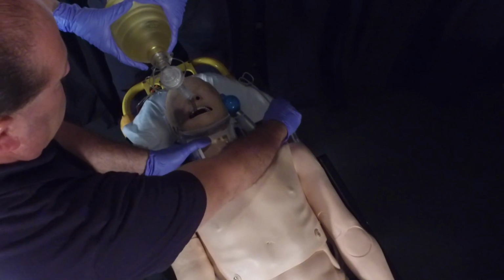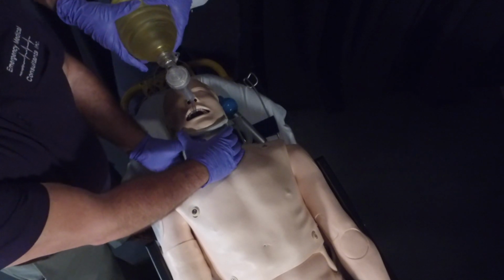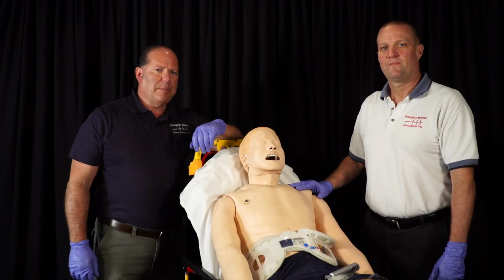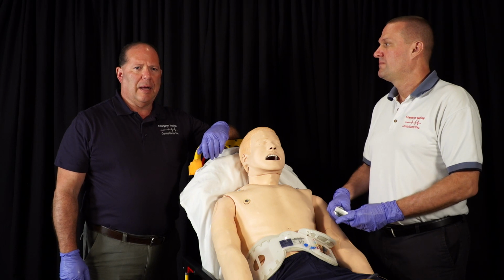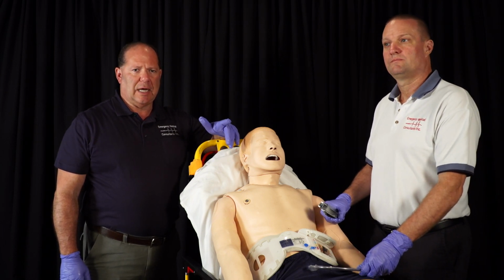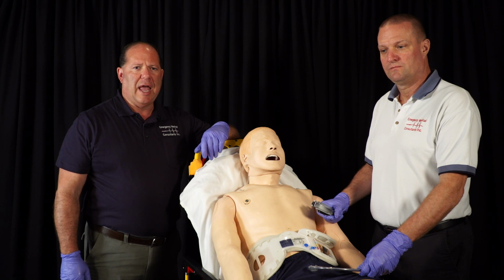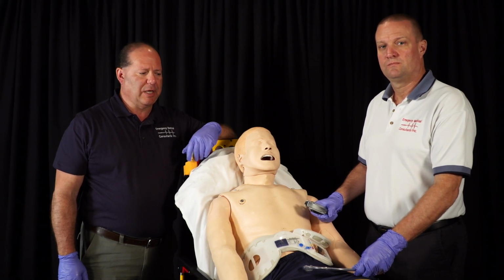Tracheal tube placement is then evaluated in the normal manner, checking for epigastric sounds, checking for lung sounds, chest rise, and monitoring end-tidal CO2. Intubating patients in a unique position, such as trapped in a car, pinned somewhere, or in unique areas, sometimes from the front is called a face-to-face intubation. We've also heard this called a frontal intubation or a hatchet intubation or a tomahawk intubation.